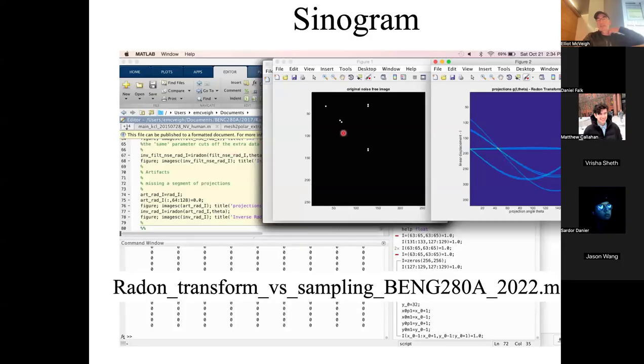There is a MATLAB thing, only 100 lines or something, that's really simple, in which you can put points in the x,y plane and see what the G(L, theta) is for those simple points. I want to give away the punchline, but for any point in the plane, its G(L, theta) is basically a sine wave of a different amplitude, okay? All the frequencies are the same, just the amplitude changes because you're just rotating around once, right?